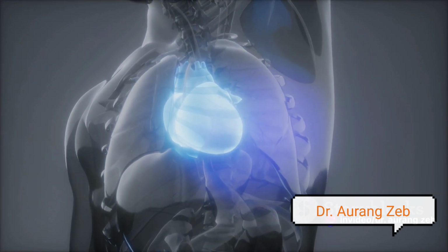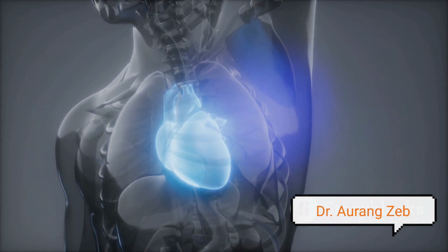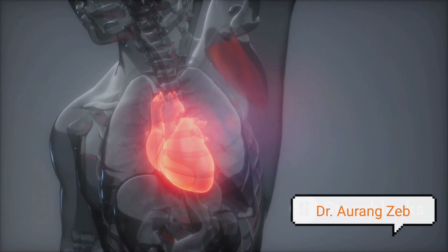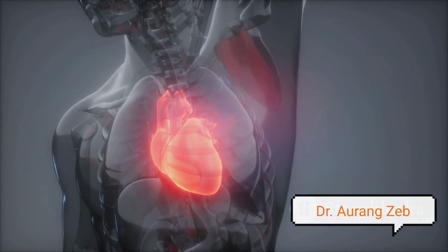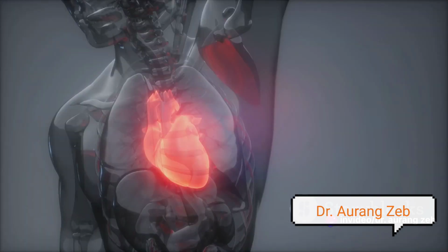The apical two-chamber view is similar to the four-chamber view, but it focuses on the left side of the heart. This view gives us a better look at the left atrium and left ventricle, and the mitral valve. Here we measure the size of the left atrium and left ventricle, and assess the function of the mitral valve.